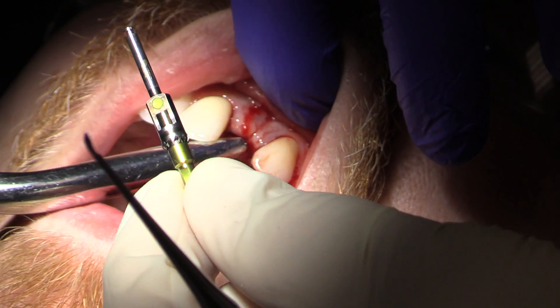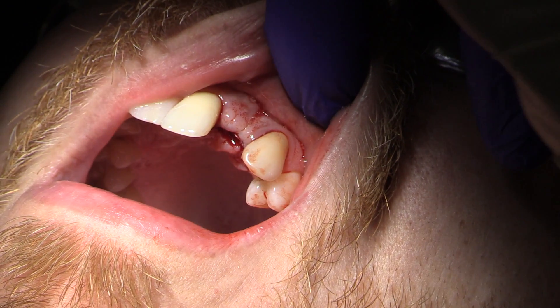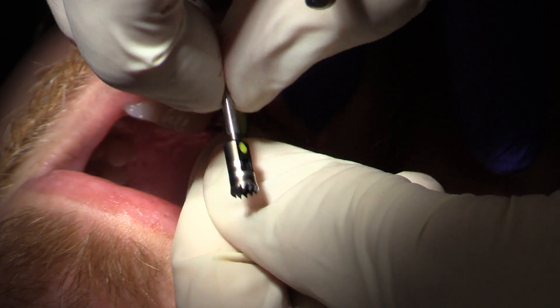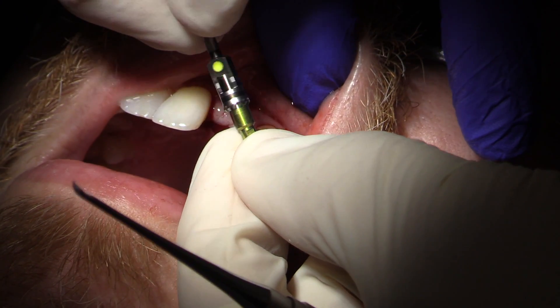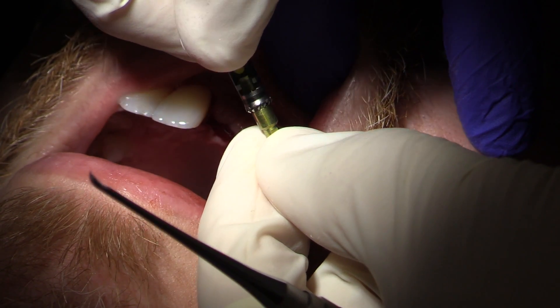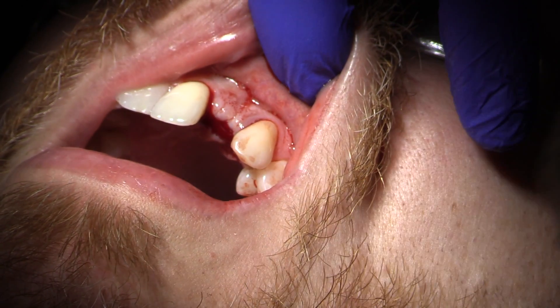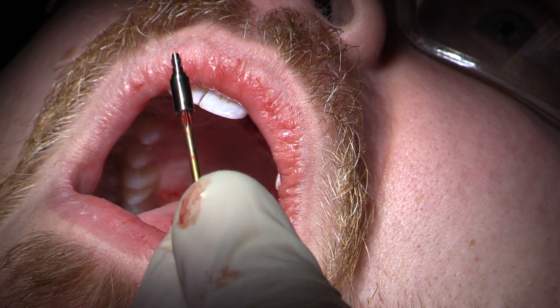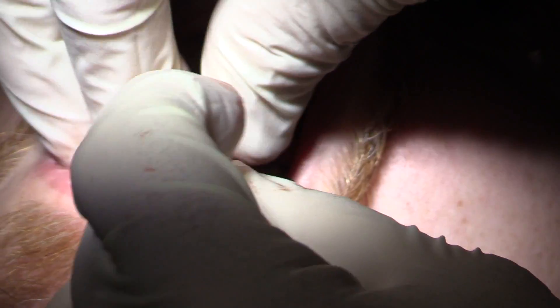The CC bone mill comes with two components. One looks like a healing abutment that screws down on top of the implant. The bone mill itself has a flare on top — you can see the bevel that bevels back so we get the emergence profile to clean the bone around the top of the CC implant. It protects the platform shift so it doesn't touch it at all, which makes it a fantastic tool. You need to have this in your kit if you are doing any CC type implant system, because all three of those systems maintain bone extremely well.